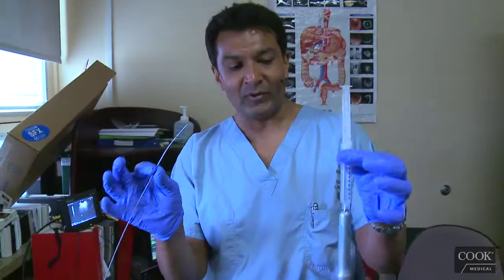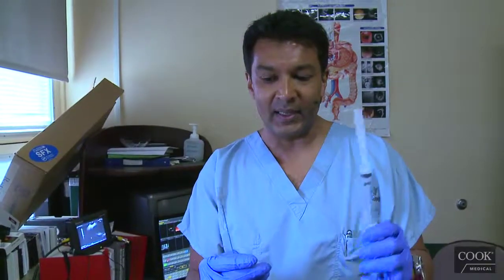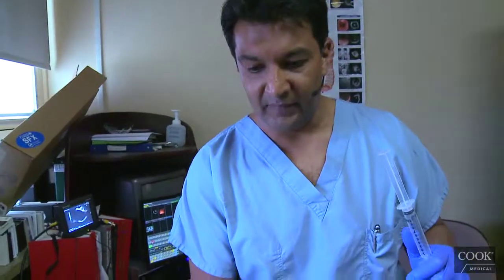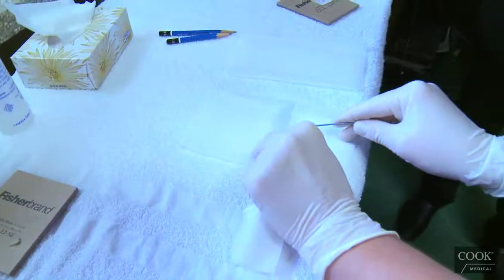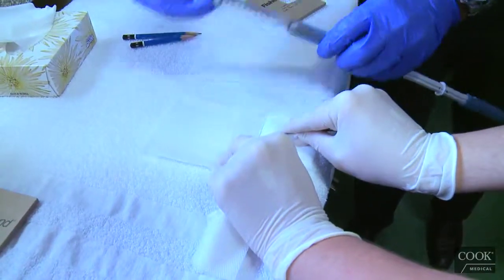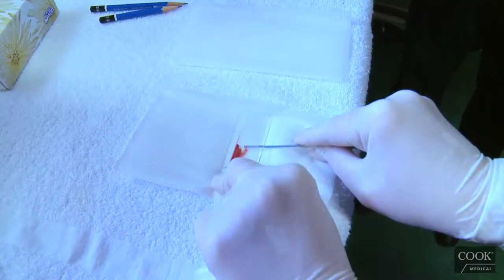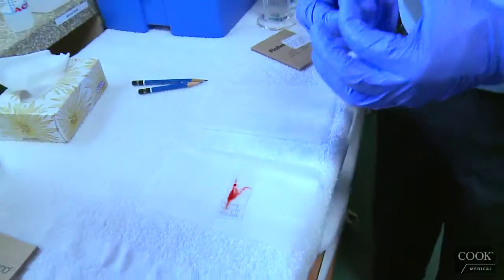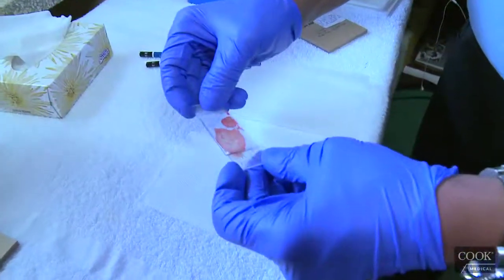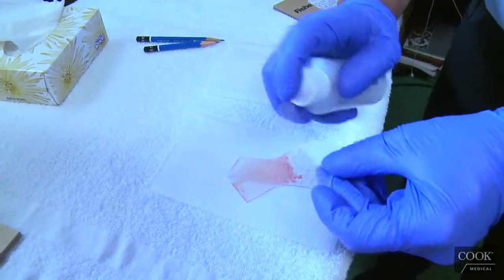So we have no stylet, so the syringe is on the needle here. So I just take this. We don't use the stylet to push anything out unless it gets clogged. So she's going to just point this over there, go to the slides. And so I'm just taking the air and pushing it on like this, and I just push it all onto 2 slides. That's it. All the material on 2 slides, that's it. Okay? We don't make multiple slides. I figure the more we concentrate everything on the 2 slides, it'll spread it out like this. Then I put the spray, and that's it.